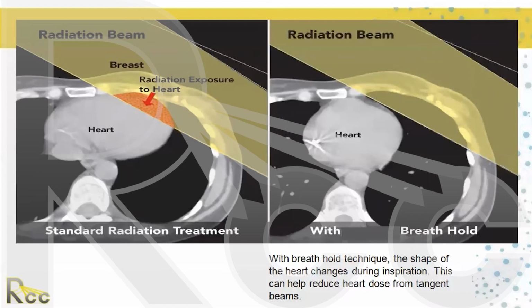All right, great. I see Ben is answering the next question, so I'll move on to Nicholas's question. How can one cater for the portal imaging dose in the cumulative treated dose on the Linac? Okay, so good question about including portal imaging dose.